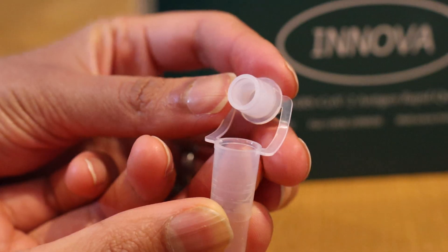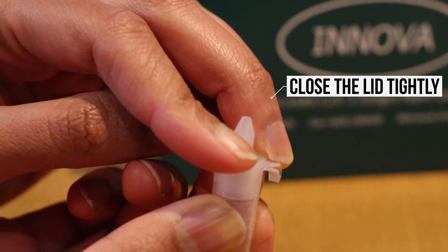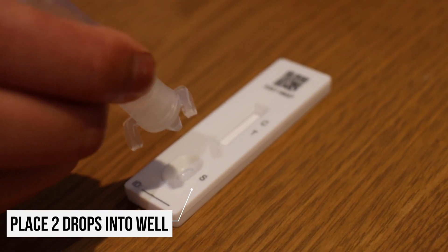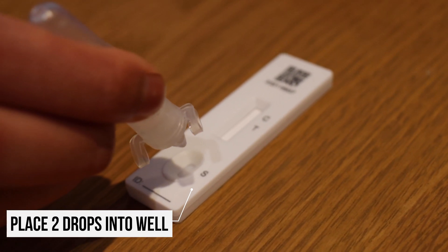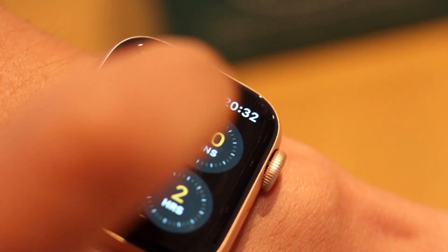Close the lid nice and tight, then get ready to put two drops onto the testing cartridge. The results will take 30 minutes, so set yourself a timer — the test cannot be read until the full 30 minutes have been completed.